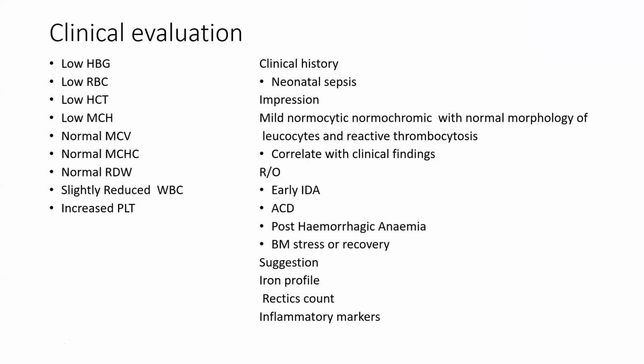Can I say something here, please? Yes, please. I just want to make a little intervention here. I agree with Doc when he said iron deficiency could also be suspected. It's called covert iron deficiency. It's iron deficiency uncovered. When it is open, that is where you see all the parameters, so that one is overt or open. And what we were supposed to have done was to have examined a smear, and that, for example, will tell us indeed whether the platelet we are seeing is a case of what we are calling reactive thrombocytosis.